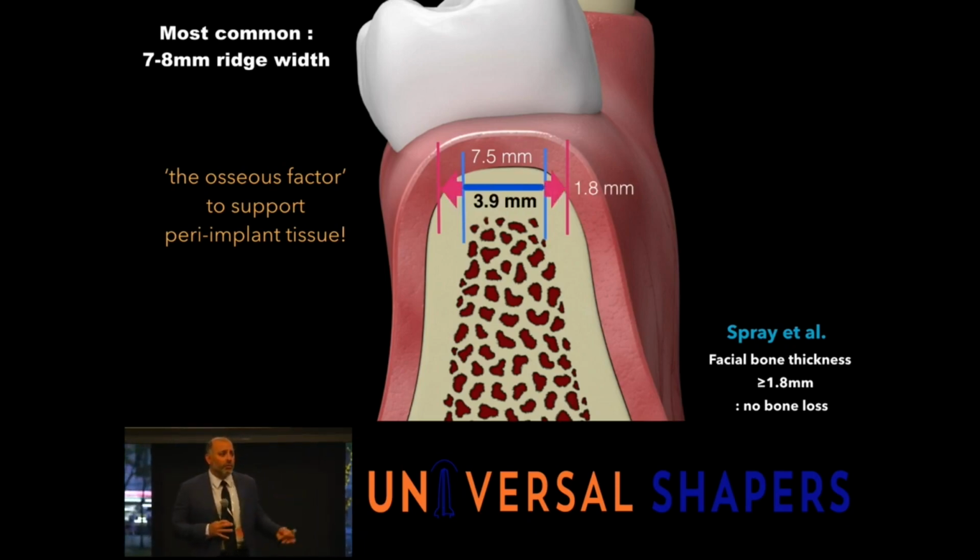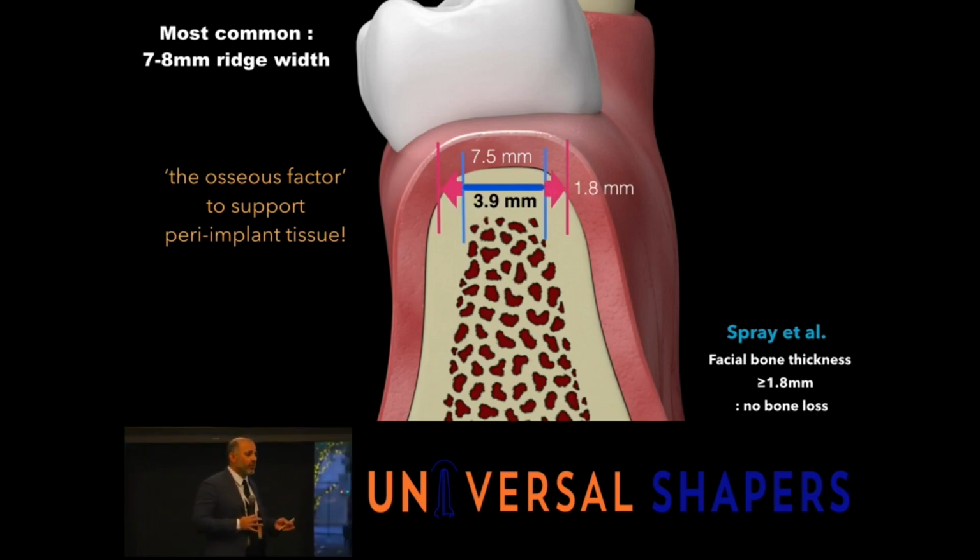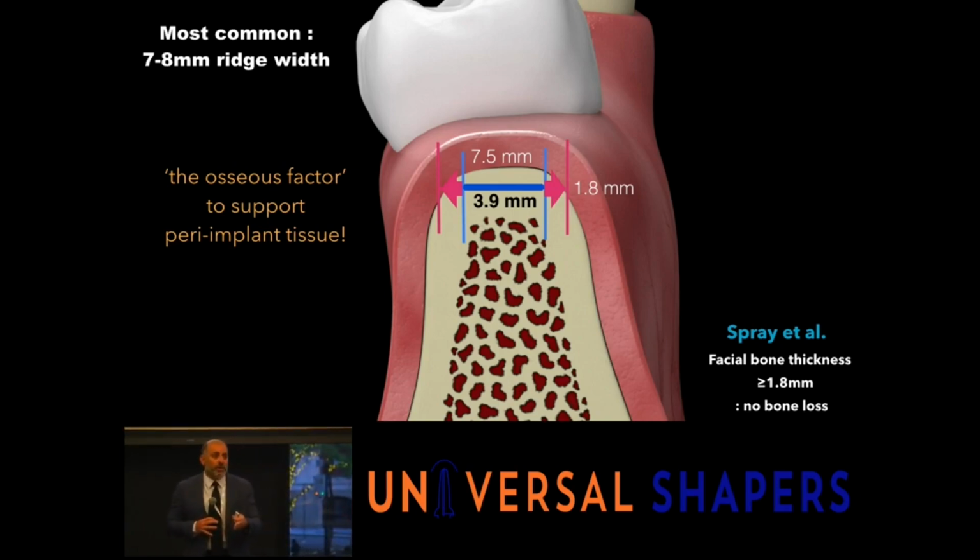You may know some of the rules, like from Spray, Nozawa, Etimoto, Grunder, who did studies, but we basically need about 2 millimeters minimum on the facial plate surrounding the implant. We cheat on the lingual or the palatal side, but we never really like to cheat on the buccal portion. And when we cheat too much, because who can be so perfect with a 7, 8 millimeter ridge, placing a 4.5 or 5 millimeter implant to get 2 millimeters on one side and 1 millimeter on the other, maybe by the use of guided surgery, dynamic navigation, maybe we can accomplish that.